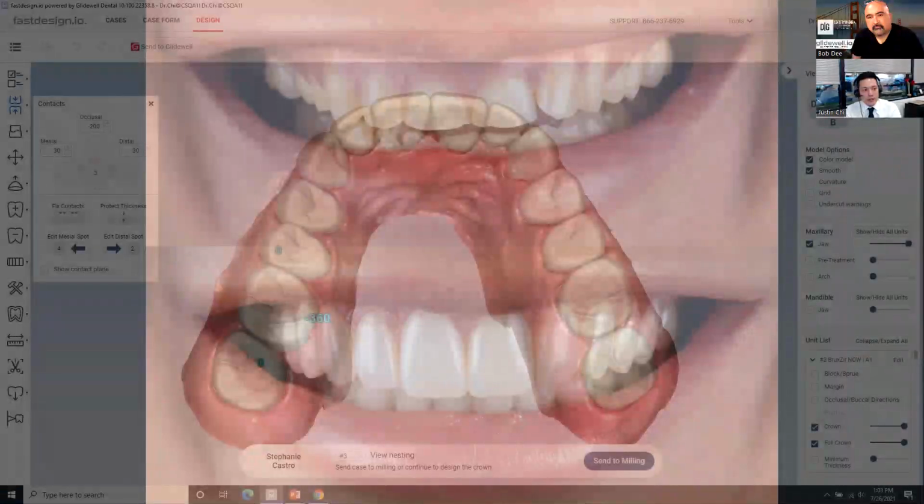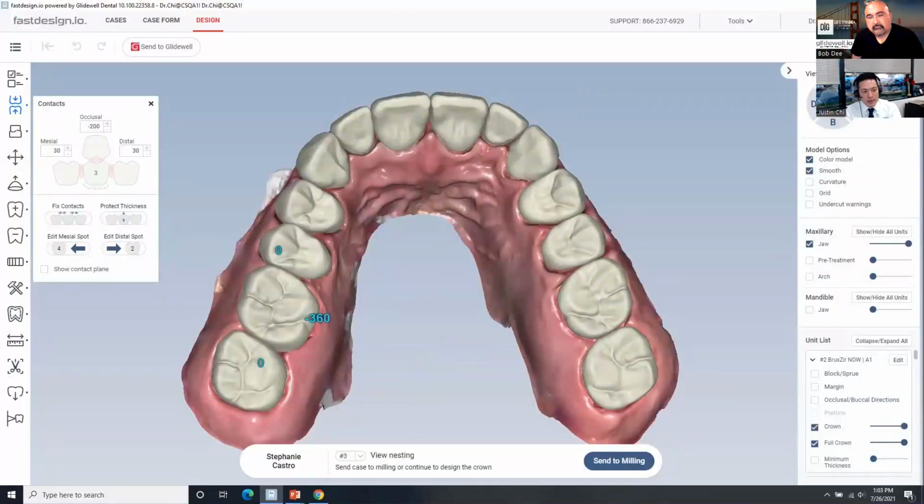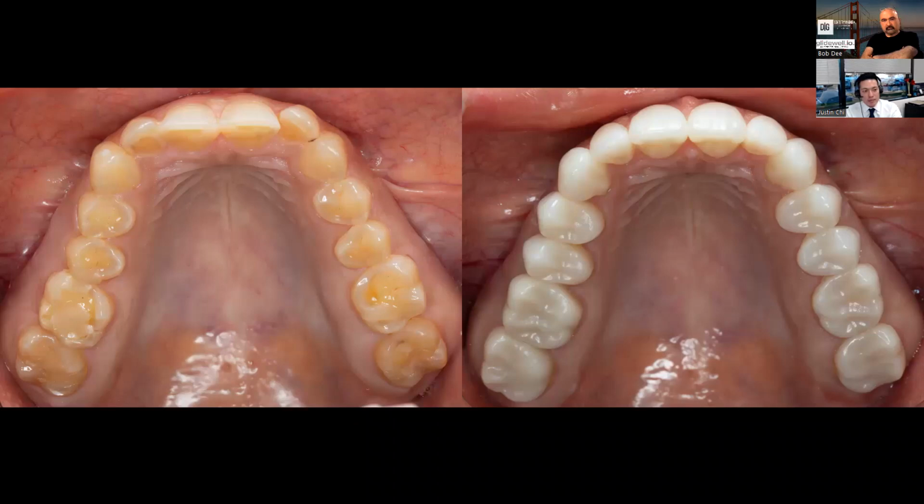So this is the occlusal designs, and you can see those numbers there on number 3. The designs are set to the same occlusal parameters and proximal contact parameters that I would use on a single unit case. And the software, as Bob mentioned, the library teeth, I just dropped the library teeth down and set the contacts and set the overall aesthetic or functional positions where I want them.